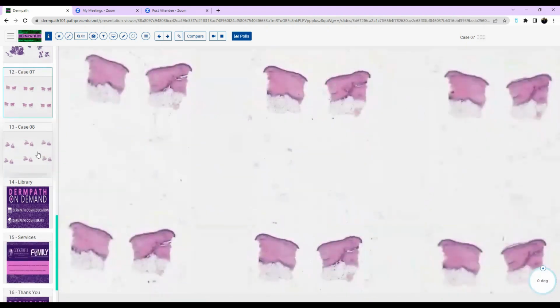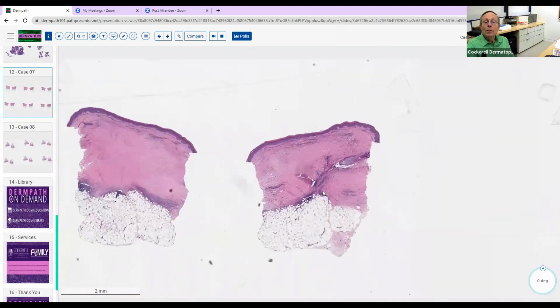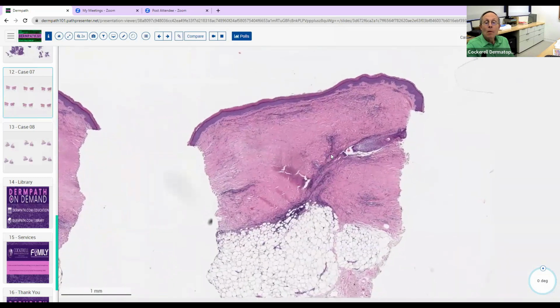Good to know. Thank you, Dr. Cockerell. You're welcome. This is a really good one also. Beautiful.